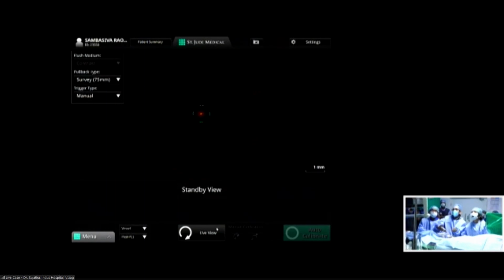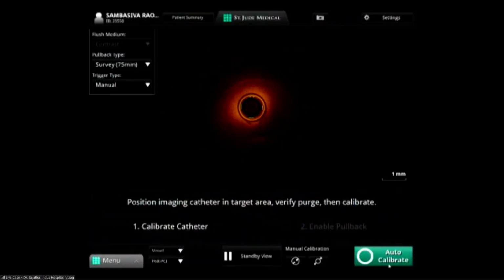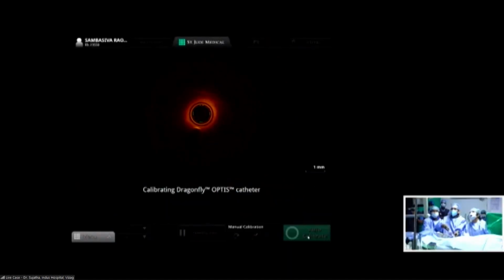I think imaging definitely helps us to make sure that we are getting the appropriate minimal stent area. Yes, sir. We want to see that and we want to see the circumflex, because I have not taken any injections. Yes, this is another important point. We can avoid taking direct injection because when you're doing the OCT itself, you get a good angiographic injection also. That saves some contrast. We have a tendency to check immediately, but when you're planning OCT, you can do it as well.